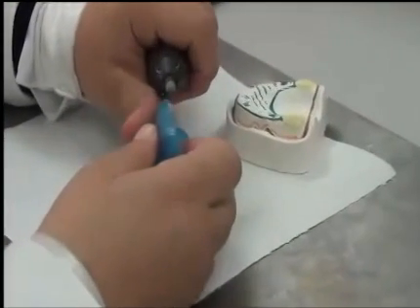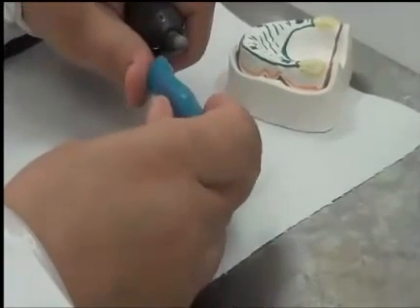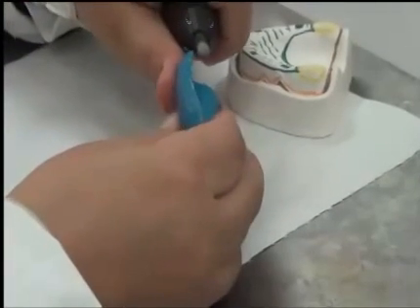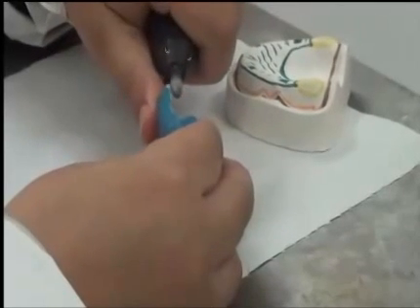If I'm doing a border, we don't point with the burr onto the surface. We put the full length of the burr on the surface. So this is the full length of the burr, and I'm simply running over the border just to remove sharp areas.